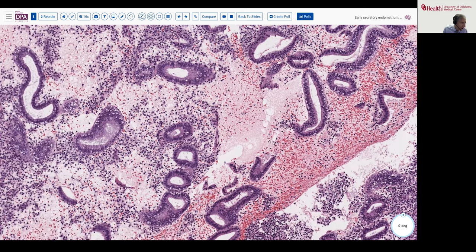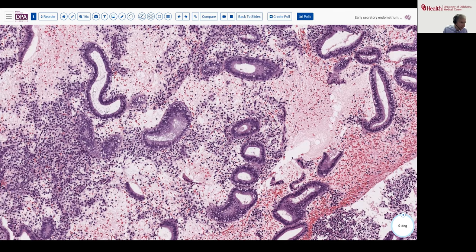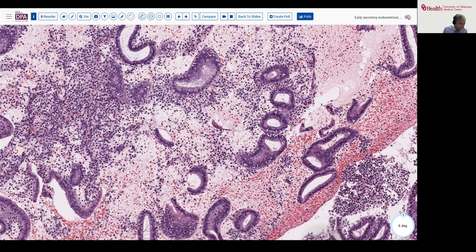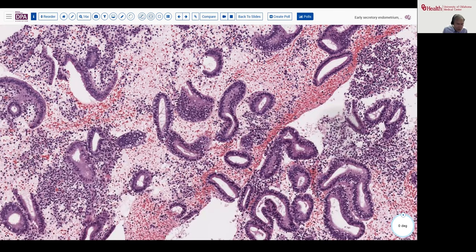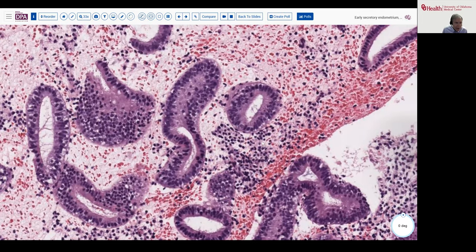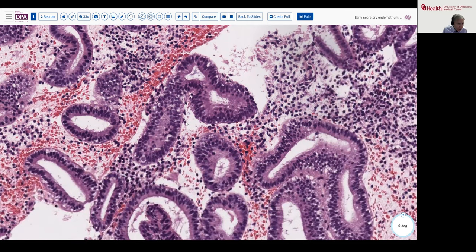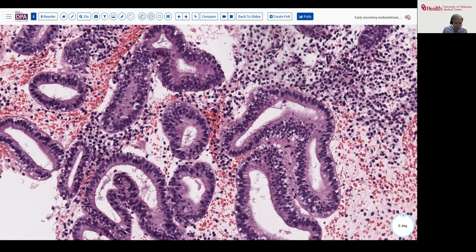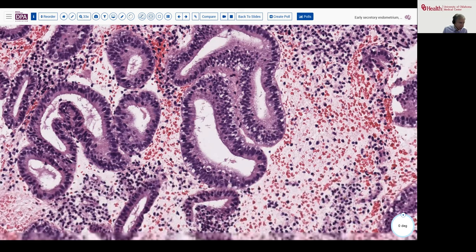In some glands, the vacuoles may be beginning to move above the nucleus. We're starting to see secretion in the lumen — a little frilly, proteinaceous fluid. I mentioned that in the early stage of secretory phase endometrium, you can still find occasional mitotic figures. They will migrate towards the lumen. They don't always show up as a dramatic finding, but you'll usually find a few still present. That indicates you're still in the very earliest phases of the secretory component of the cycle.